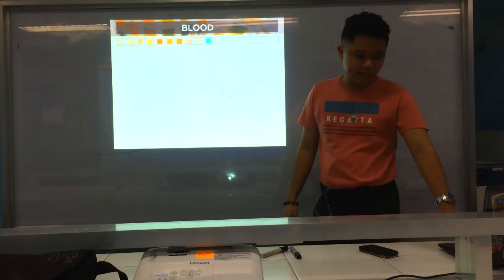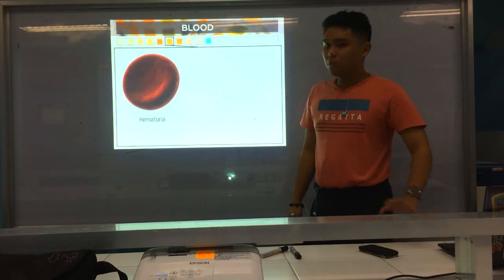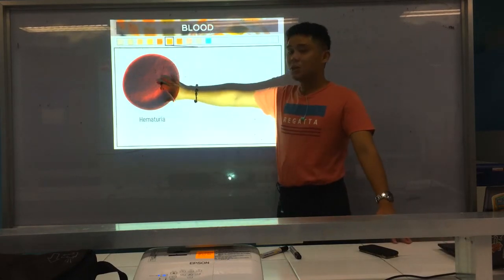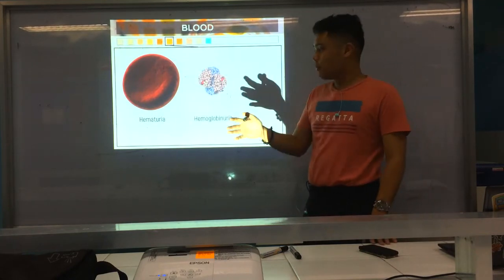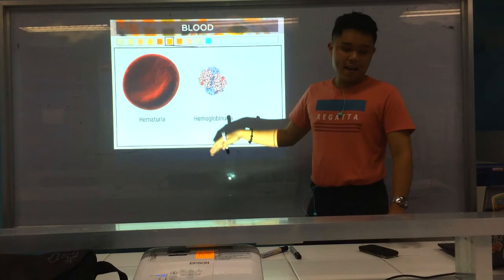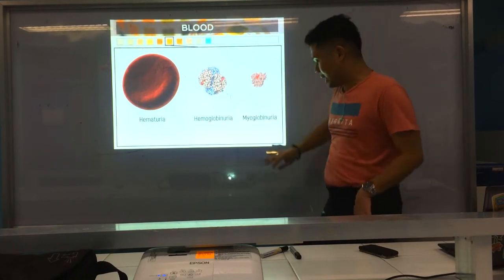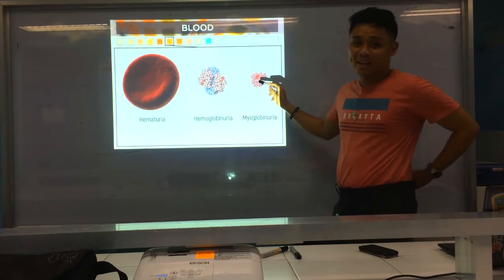Okay, next we go now to blood. So, blood in urine can be in three forms. One is hematuria, meaning the presence of intact RBCs in your urine. It could be hemoglobinuria, because of the presence of hemoglobin. And of course, myoglobinuria, the presence of myoglobin. As you can see, it is a much smaller molecule compared to hemoglobin, right? So it's rapidly cleared by the body.